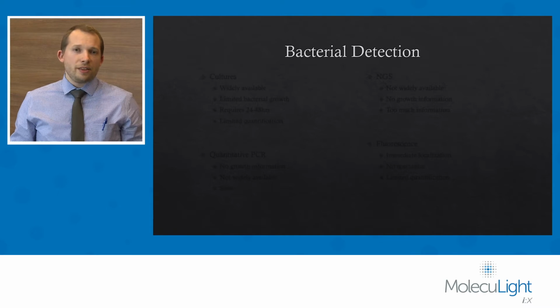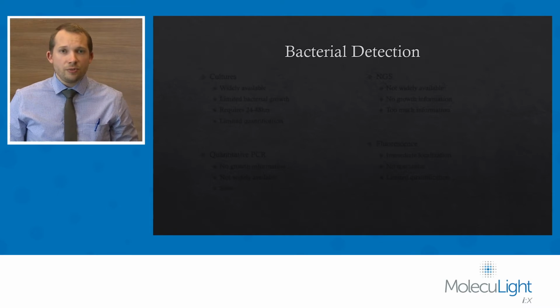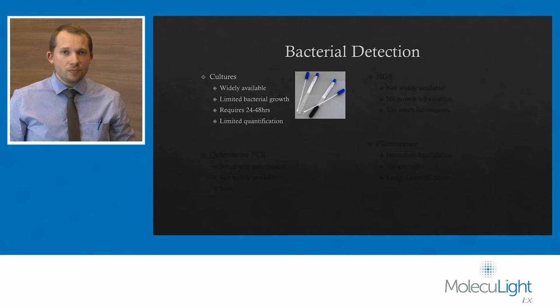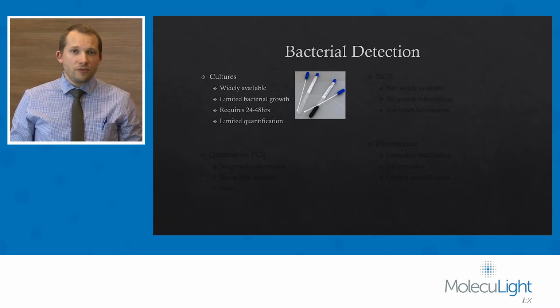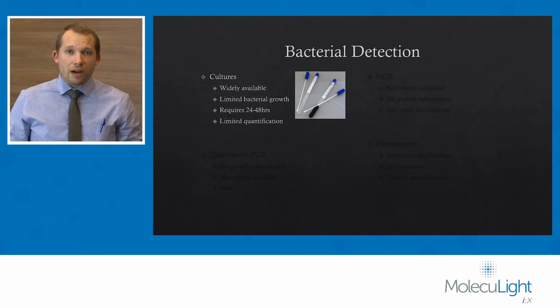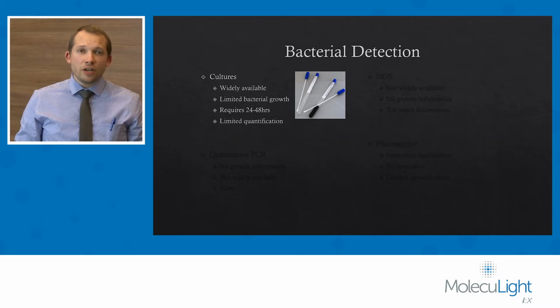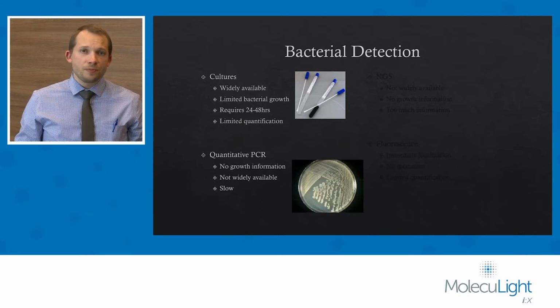Now, we have several different methods for detecting bacteria within a wound. Most commonly understood is the swab culture. This is widely available. It's been around for a long time. Problems with it, though, is that it has a limited bacterial quantification. It requires 24 to 48 hours for any kind of result to come back. And it may not necessarily grow whatever it is that's in your wound.